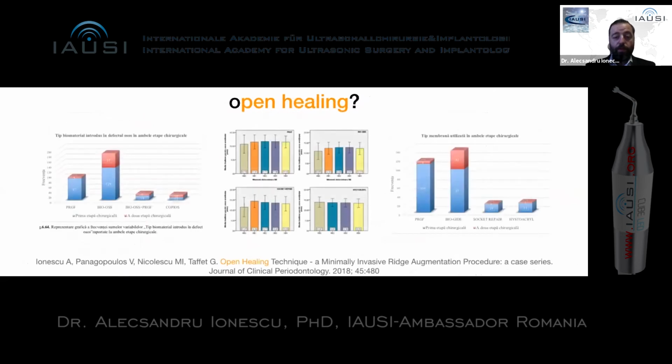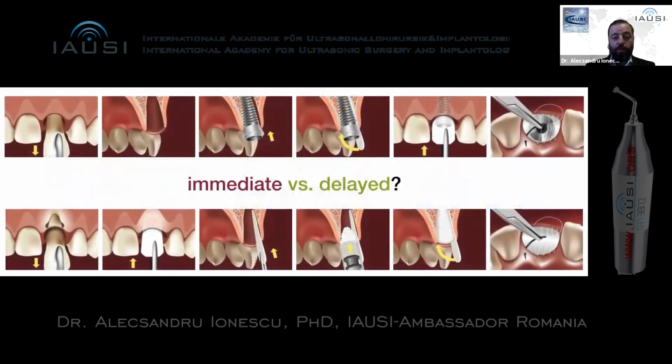It's a little bit modified, in that we are using the PTFE continuous suture above the membrane. So we are not suturing the membrane to the gingiva, the free gingival margin, as Dennis Turner did it.